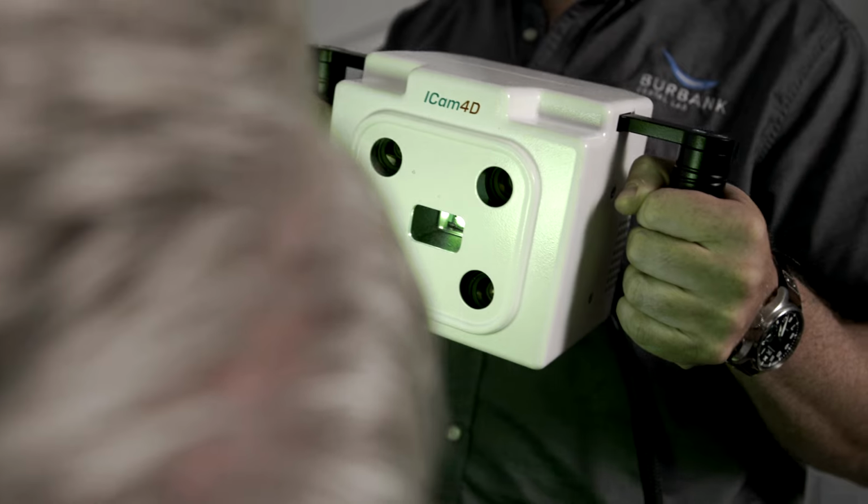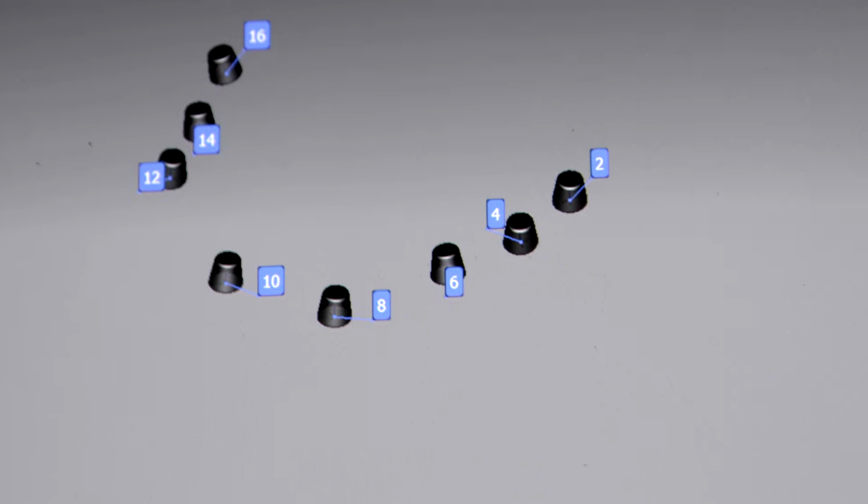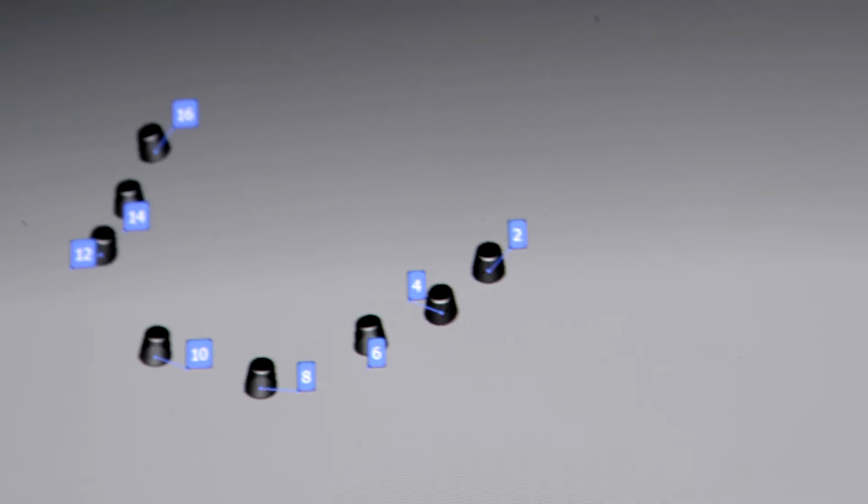And once we place the implants in the surgery, we'll ask the specialist from Burbank Dental Lab. We use scanning using photogrammetry technology, which provides an accurate replica of the position of the implant based on accurate vectors and dimensions. This cannot be replicated by traditional intraoral scanning. Definitely cannot be replicated by traditional intraoral impressions that we used to do in the past.